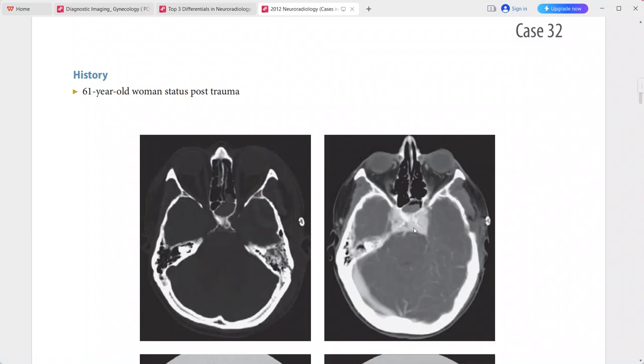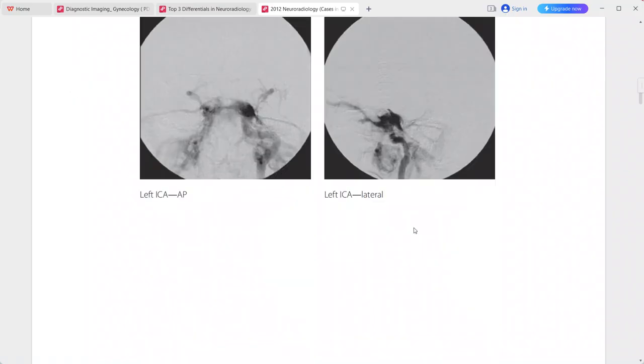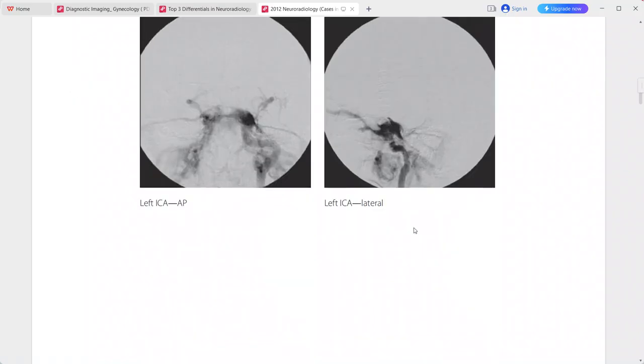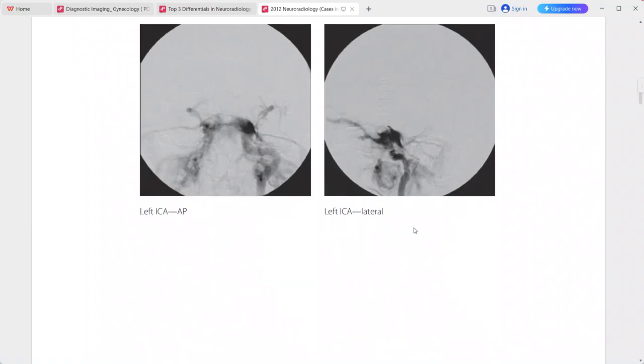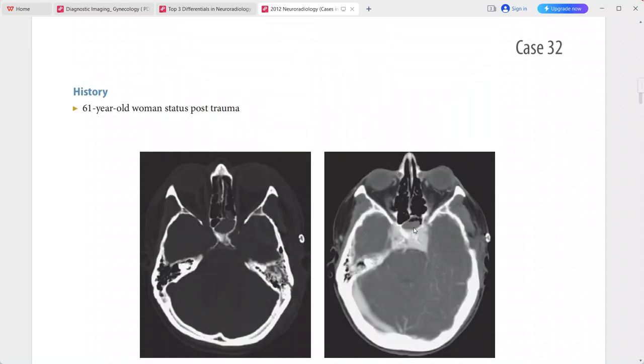Clinically, the differential diagnosis includes venous thrombosis and intraorbital hematoma. However, with these images the diagnosis is quite clear.